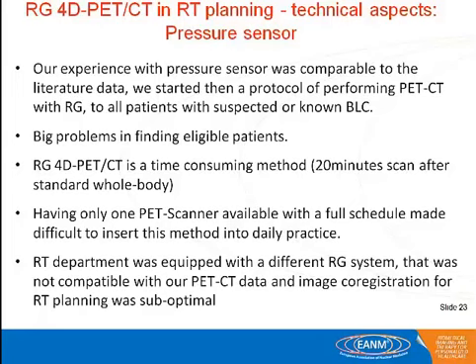It's really time consuming, more than 20 minutes just for the bed. And at the time, we had only one PET scanner available. So having a full schedule made it difficult to insert this method in the daily practice because you have to plan it the day before. It was really difficult to find eligible patients the day before.